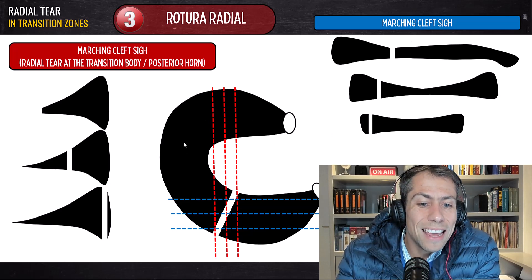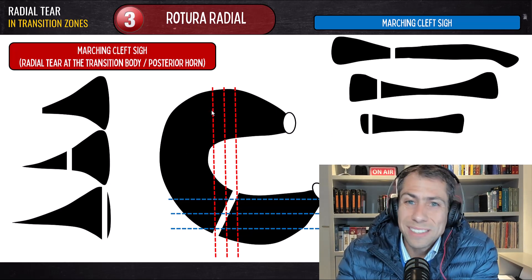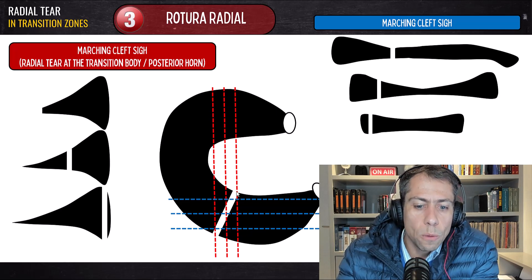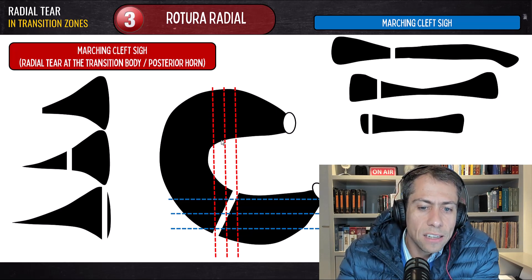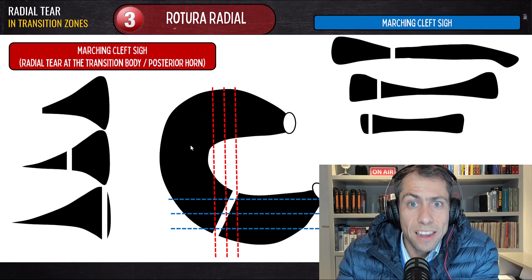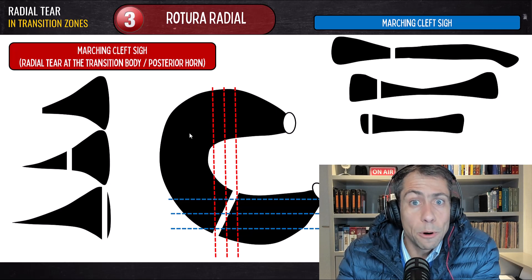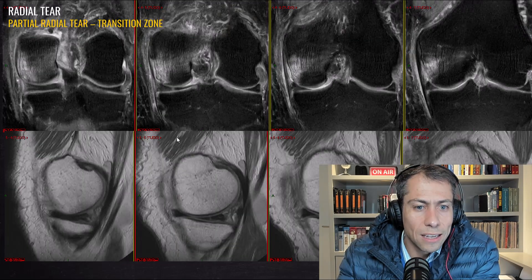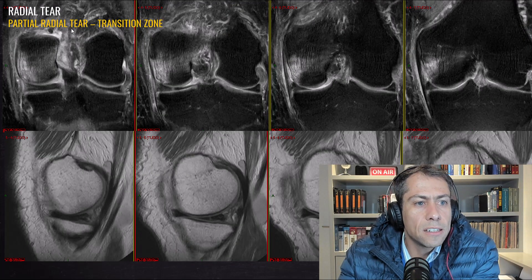In cases like that, the axial plane helps a lot, because in the axial plane we can see that the tear is linear, not curved — it's not a parrot beak tear. We should double-check the axial plane in cases like this.